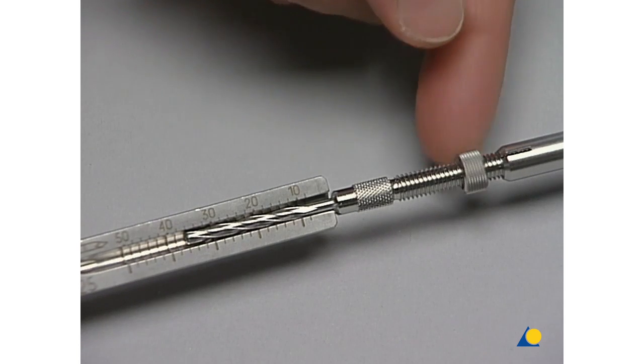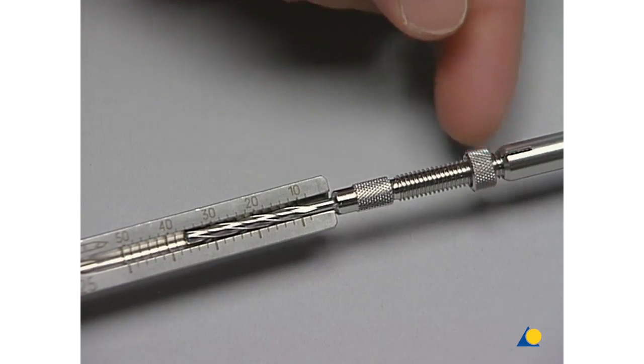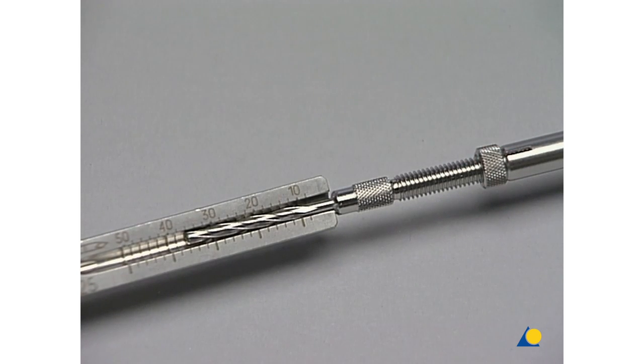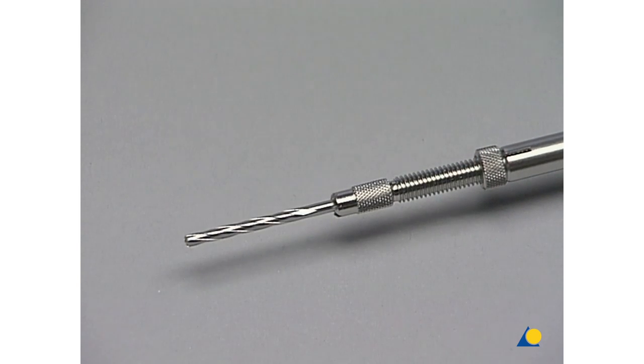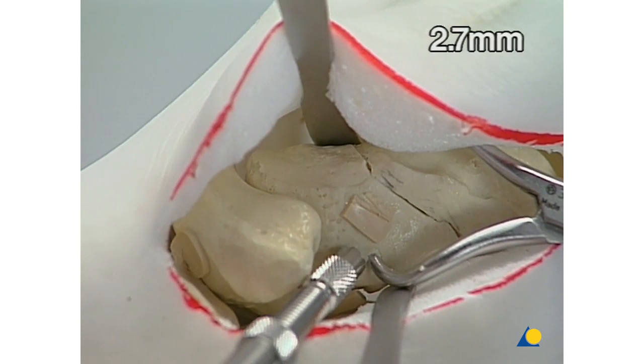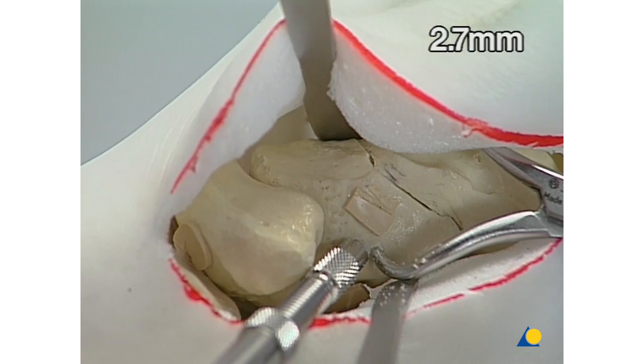In order to secure this setting, the knurled nut must always be screwed up to the stop. First, drill the hole using the 2.7mm cannulated drill bit.